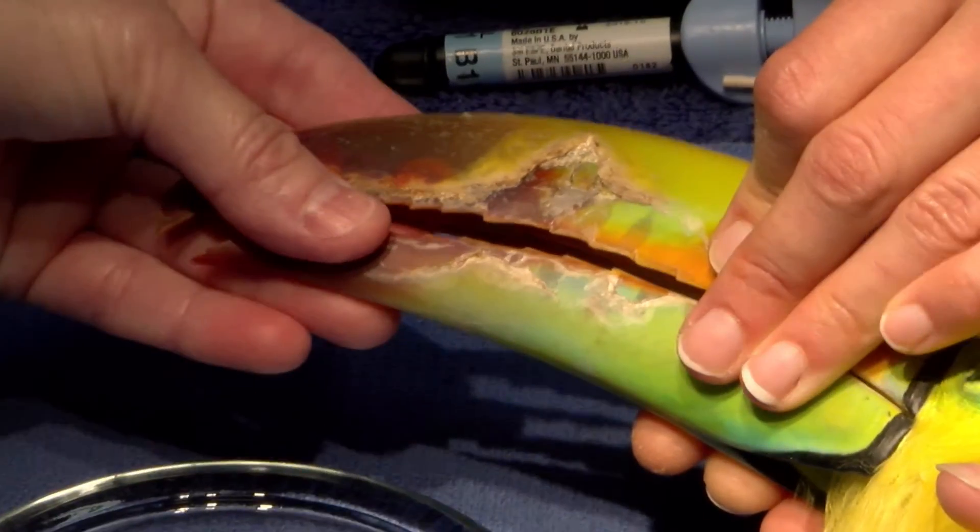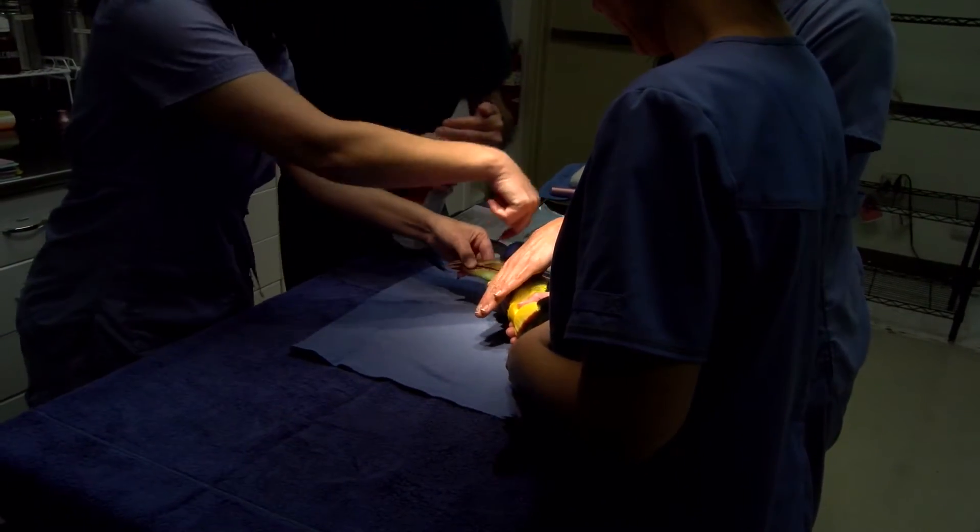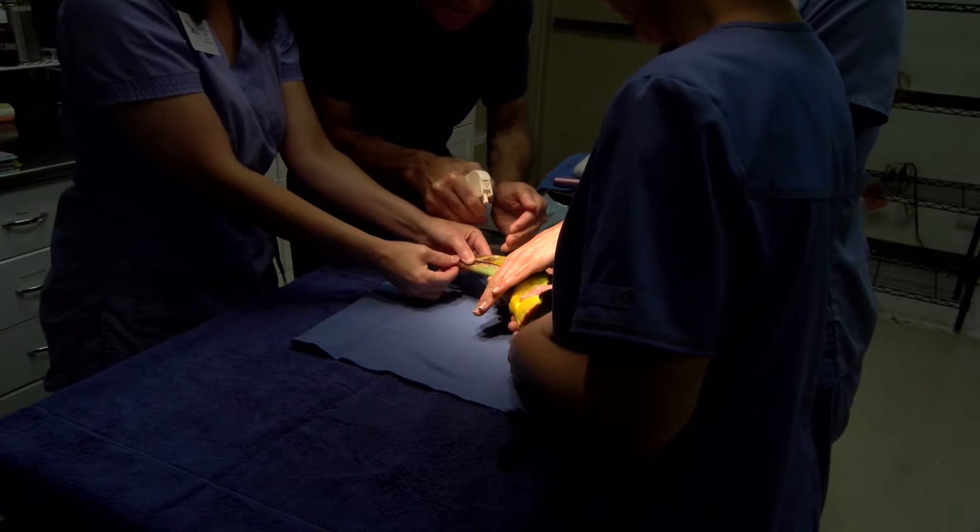You're going to be a new man, Bob. The bonding agent is dried using a compressed air tool used in pediatric dentistry.